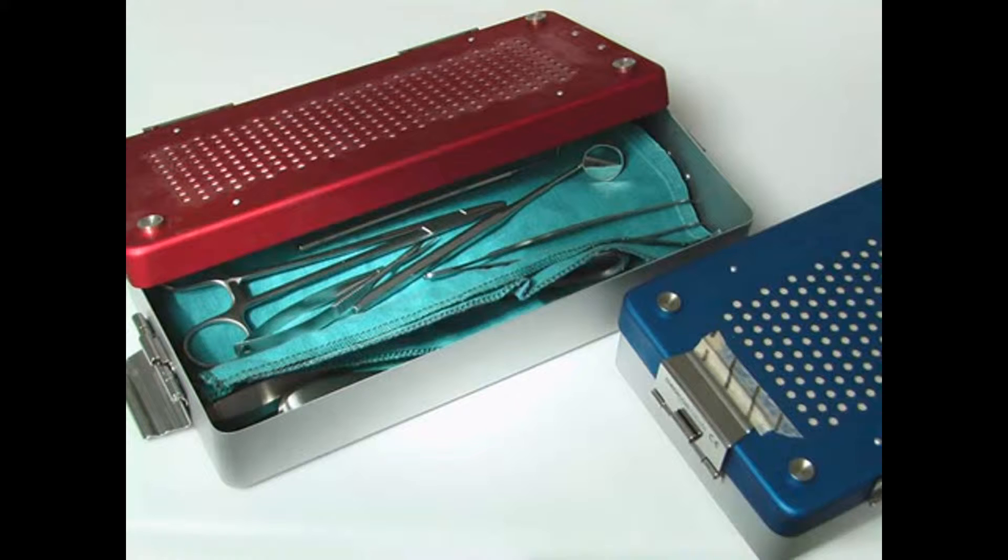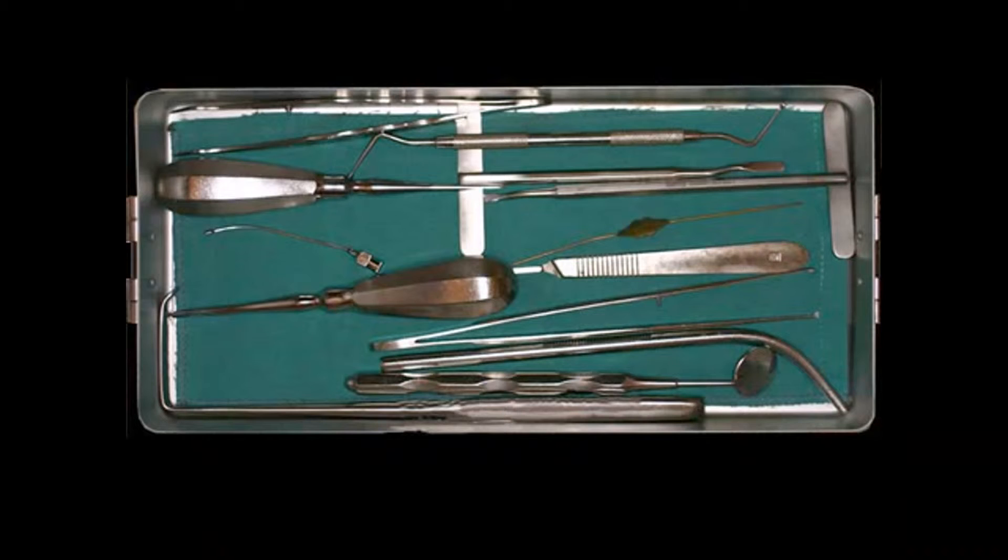It is important that these surgical instruments, like all other surgical instruments, are only used if they are sterile. You see a surgical container, where the surgical instruments are placed neatly next to one another in order to undergo the sterilization process.